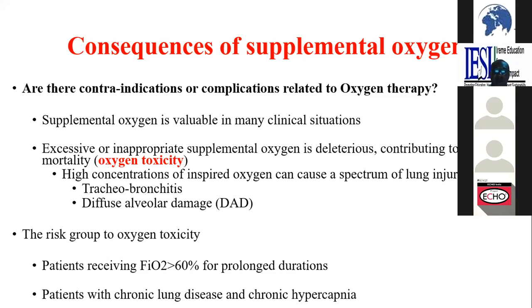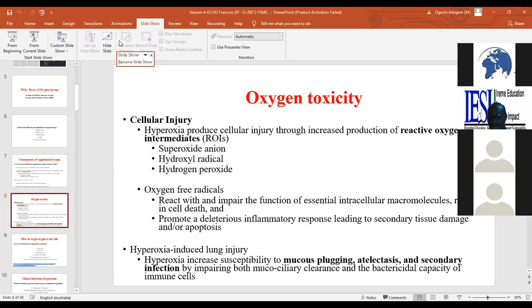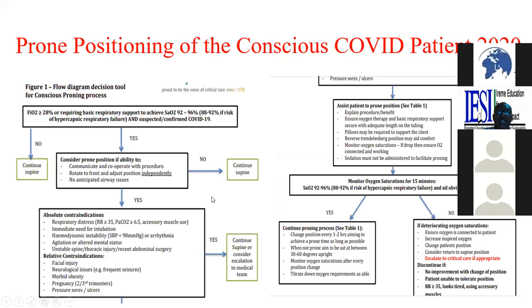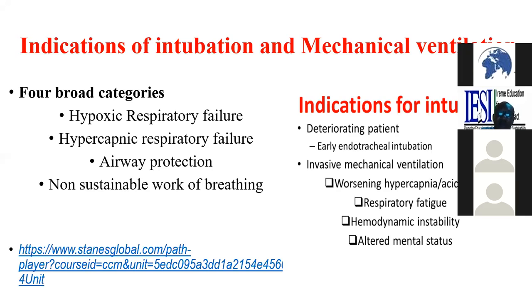Thank you. Yes, welcome. Okay, so I came back. On the long-term complications of oxygen, a patient may have nasal dryness and skin irritation, primarily in the space where your cannula and the tubing touch. And as we saw in this presentation, oxygen toxicity. Previous slide. Yes, about the complications of oxygen therapy.